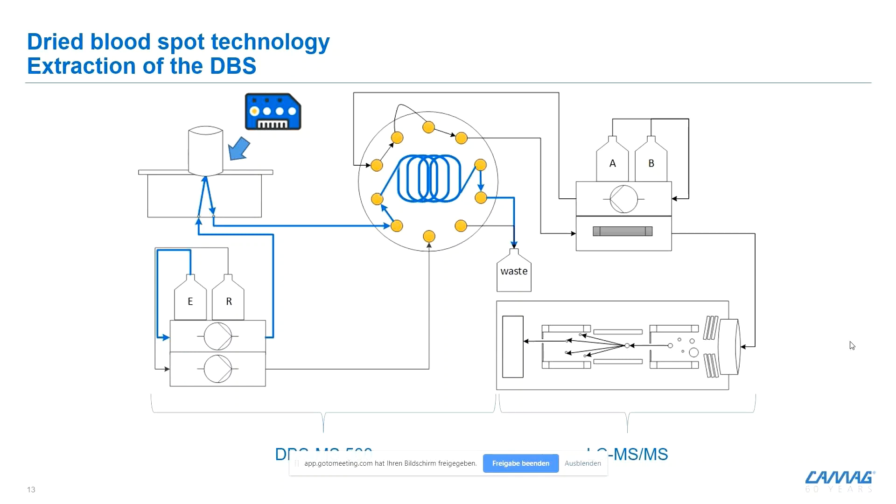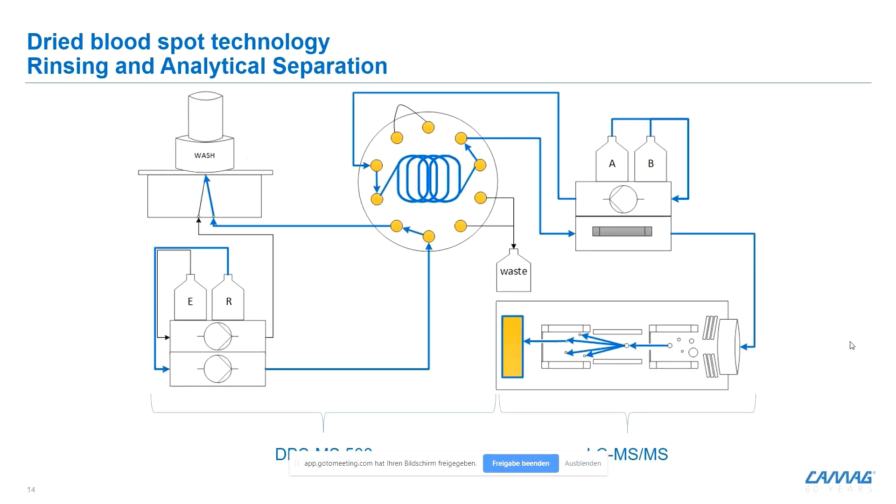The card is brought to the extraction cell, visible in the upper left. We pump the extraction solvent through the dry blood spot into the sample loop. This 10-port valve, seen in the middle, is the interface between the extraction and the LC-MS analysis. By switching this valve, the loop volume is integrated into our LC-MS cycle, and the extract goes via the analytical column into the triple mass spec. At the same time, a rinsing pump flushes the extraction outlet backwards to prevent carryover. Since LC-MS is typically the bottleneck in terms of time, the system already prepares the next sample to be injected as soon as the LC-MS is ready again.